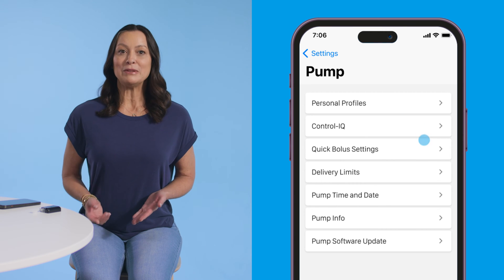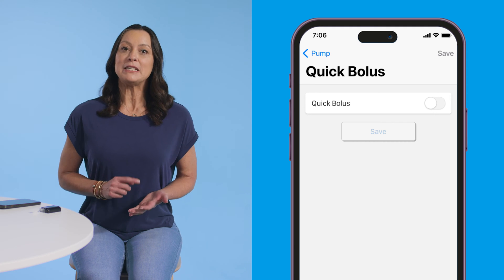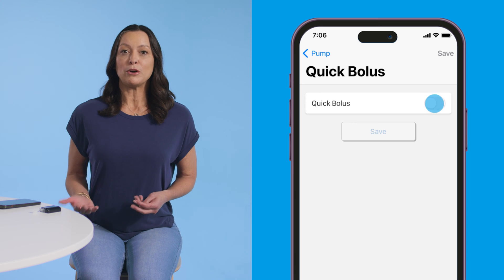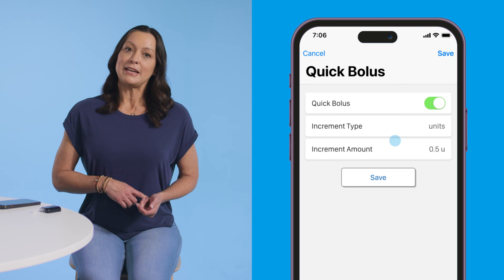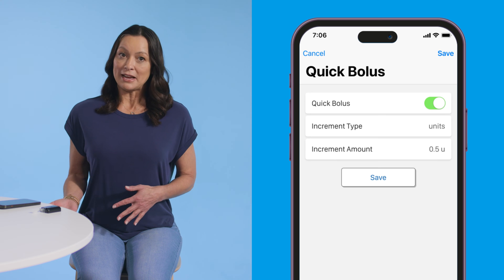Once you're in the pump menu, tap on Quick Bolus Settings. The quick bolus feature will be defaulted to the off position. You'll need to turn it on so you can program the settings for the increment type and the increment amount. Next, hit the Save button to save your settings — if you don't, your settings won't be saved.